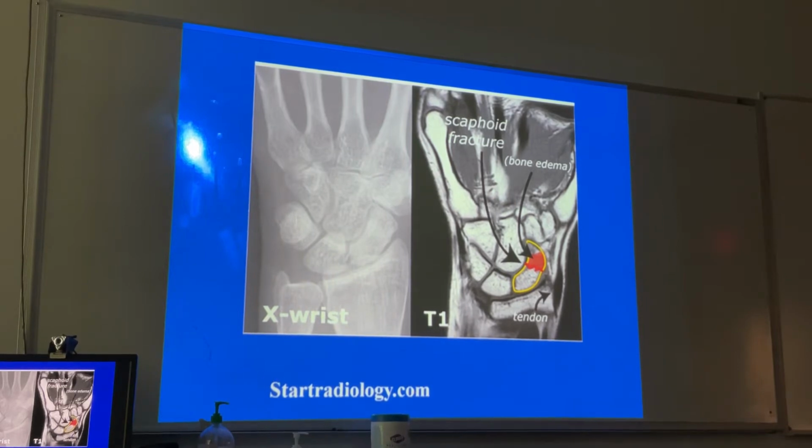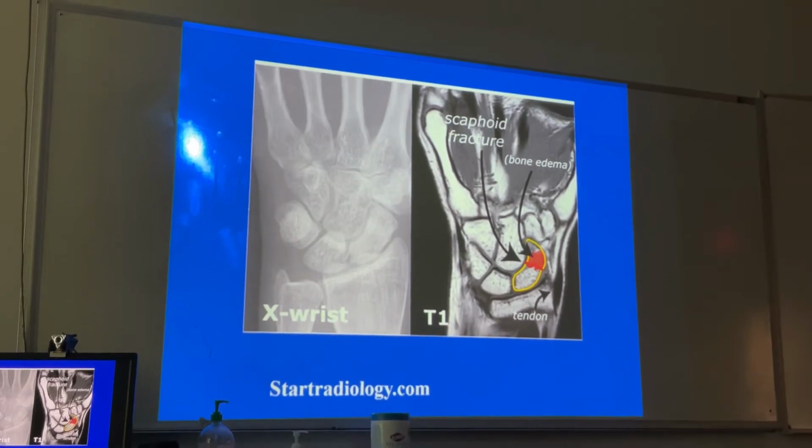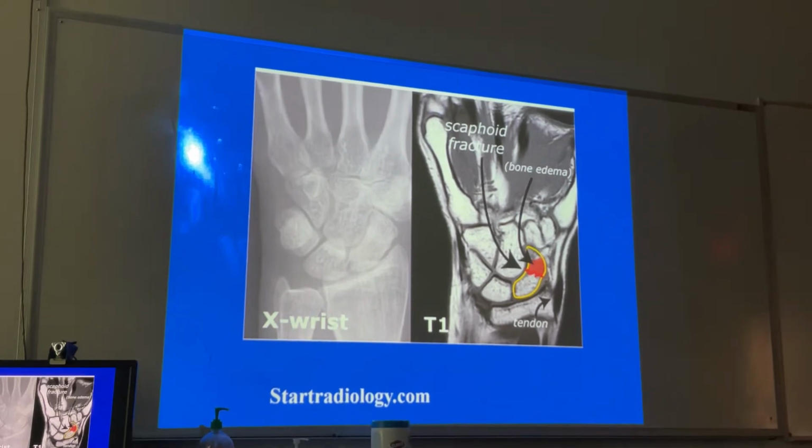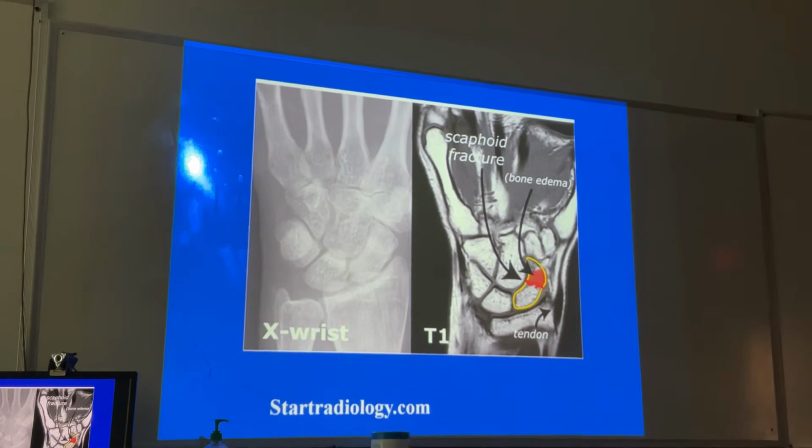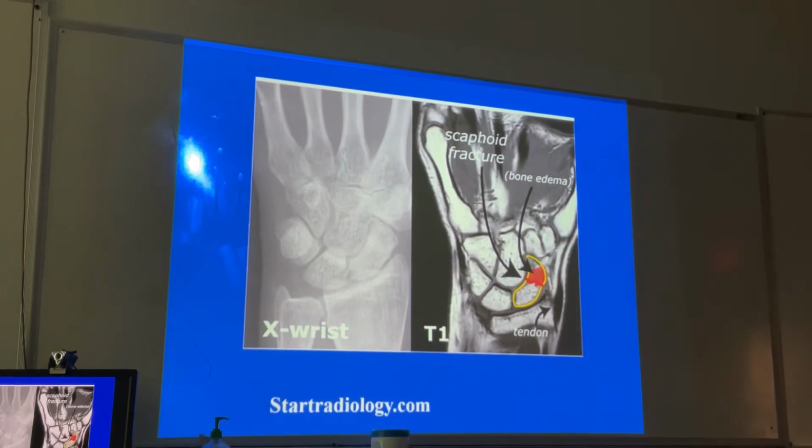This is out of the Netherlands, I think. I can't say she's done all the anatomic areas of the extremity of the appendicular skeleton, but what she's done well, if you like that, it's worthwhile looking at. The other point is, this is how National Board Part 3 works, plain film.